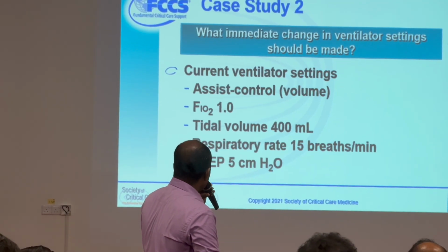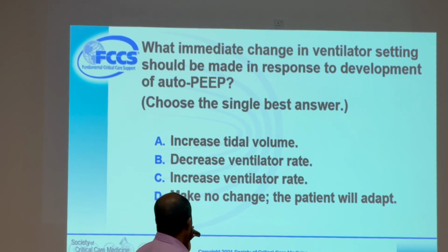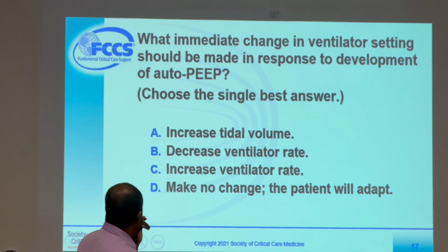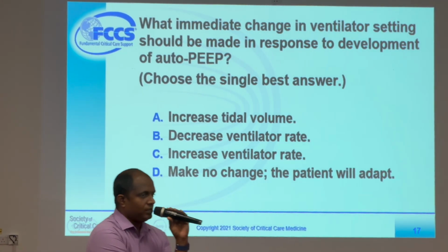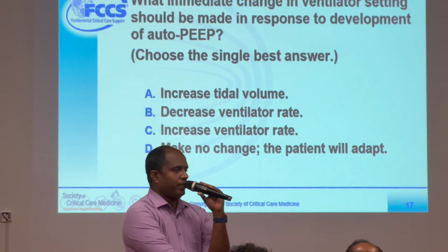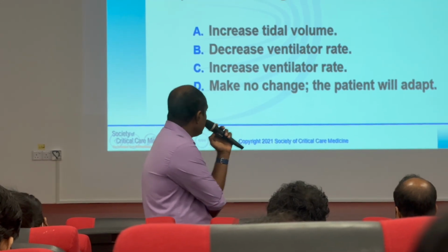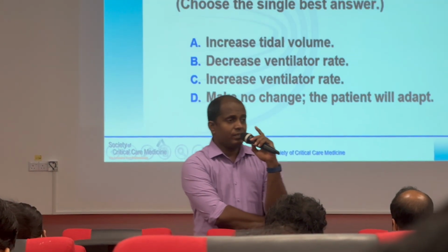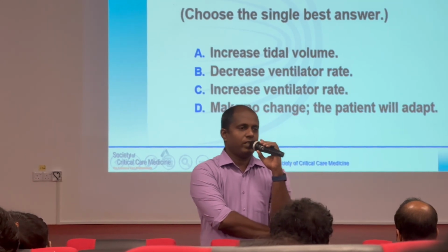So this one I already discussed. So what is the immediate change you do? Given answers, reduce the respiratory rate. If I put the fifth one, reduce the tidal volume, that also has to be considered.